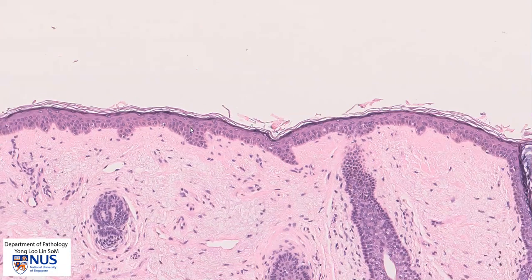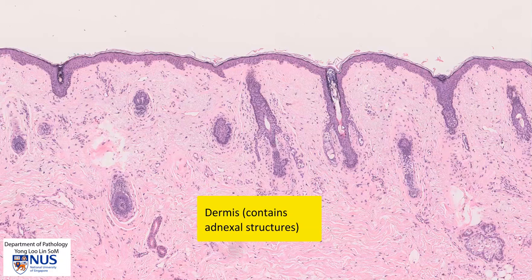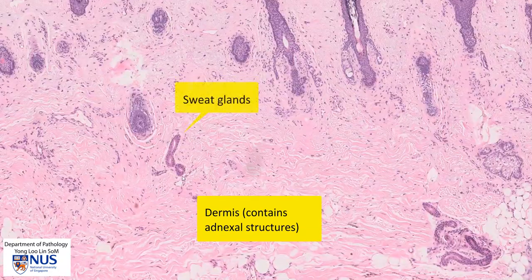Below this we have the dermis, which is mostly pink because it is composed of collagen, and this contains the adnexal structures such as the pilosebaceous units and some of the sweat glands.